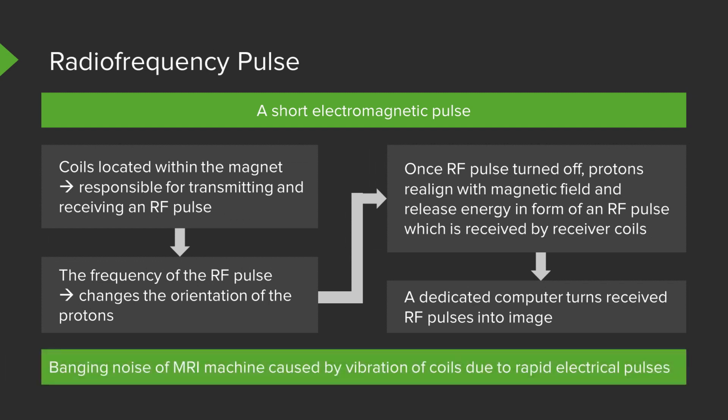The banging noise of the MRI machine, which some of you may have heard, is actually caused by vibration of the coils, which is due to rapid electrical pulses going back and forth.